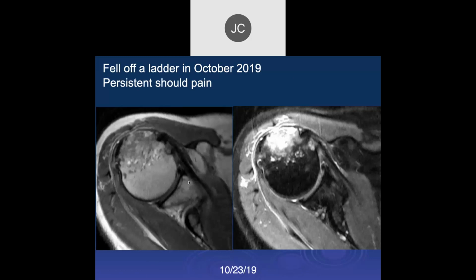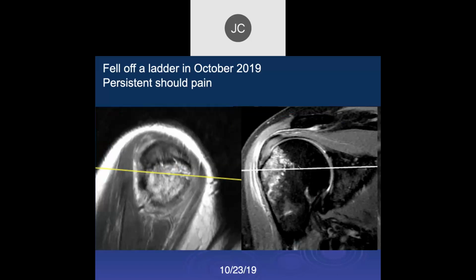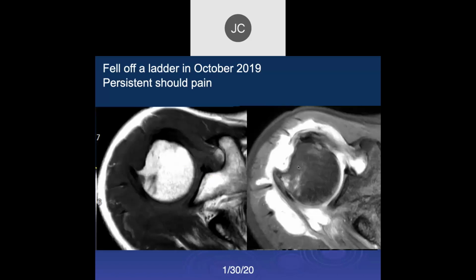Okay, fell off a ladder, persistent shoulder pain. On the right PD fat sat image, I'm seeing a lot of edema in that lateral humeral head. Yeah, with trauma, a lot of edema. Could be an impaction injury. Maybe a little bone fragment there on the sagittal view on the left. So this is displaced. 10/23/19. Now we're going 3 months later, and this is what it looked like.